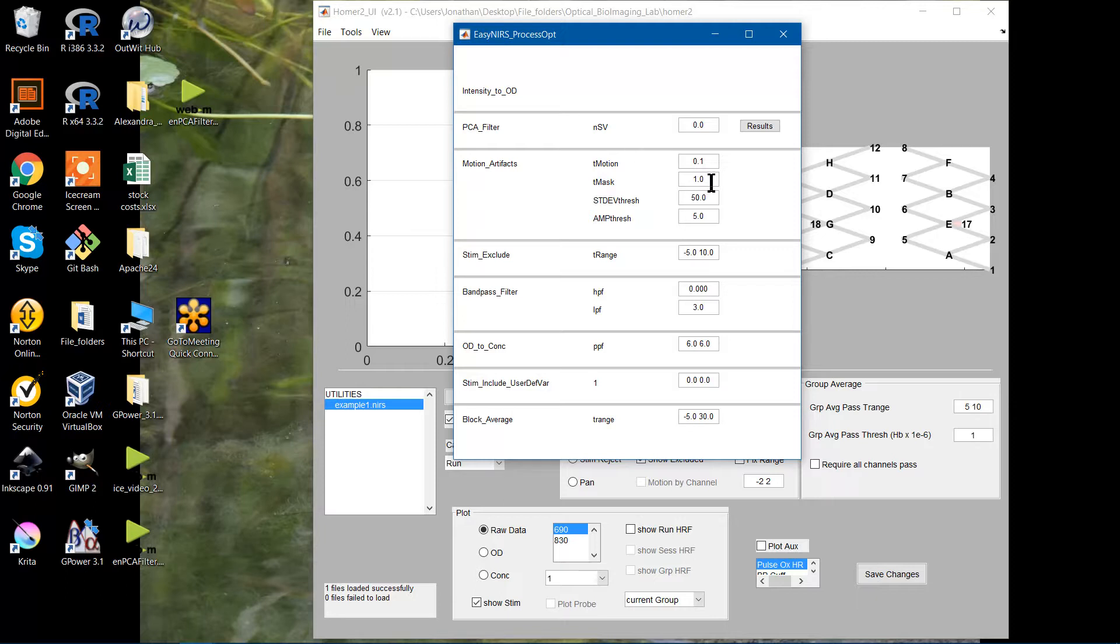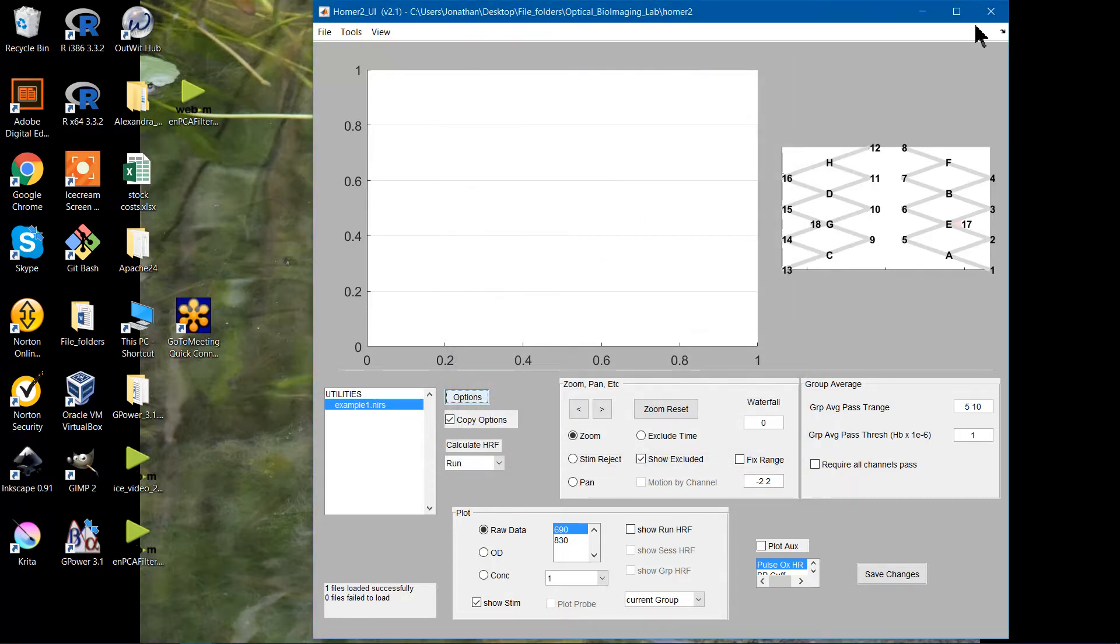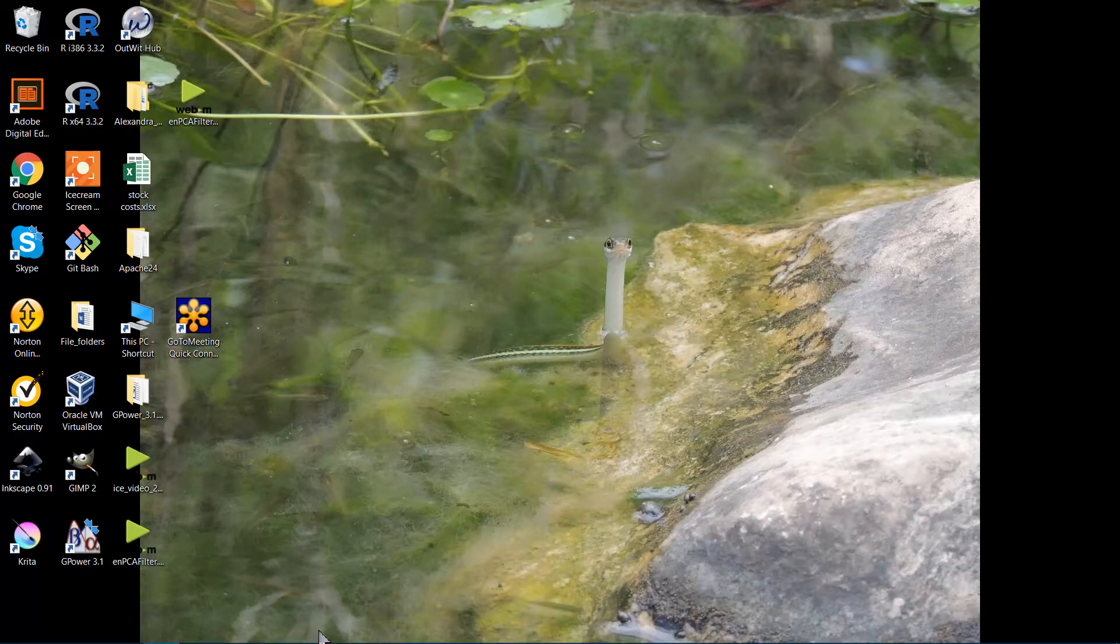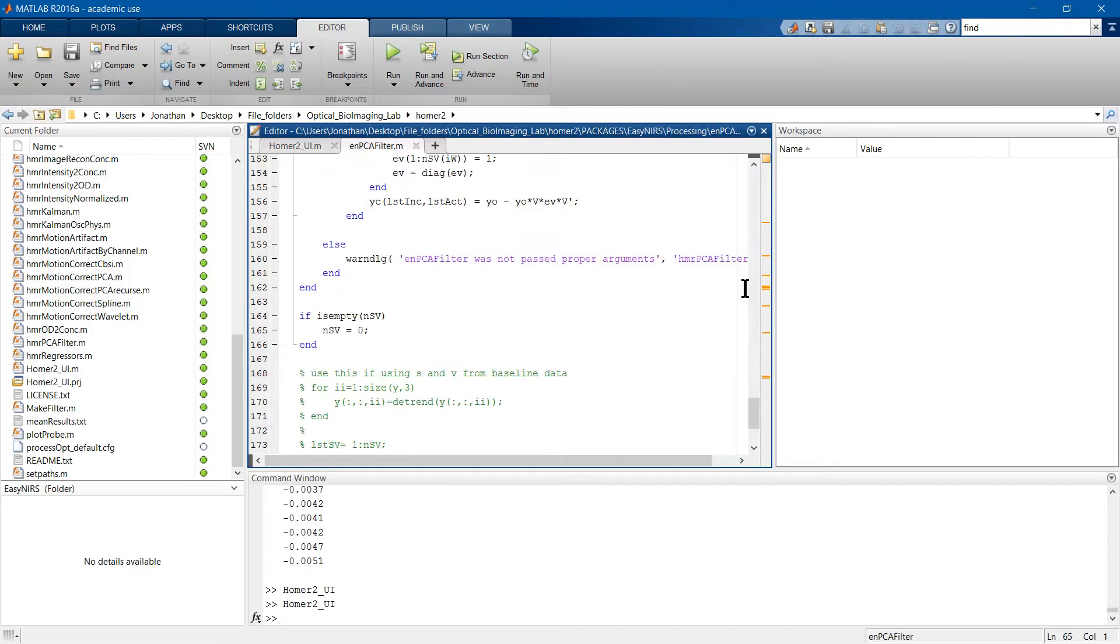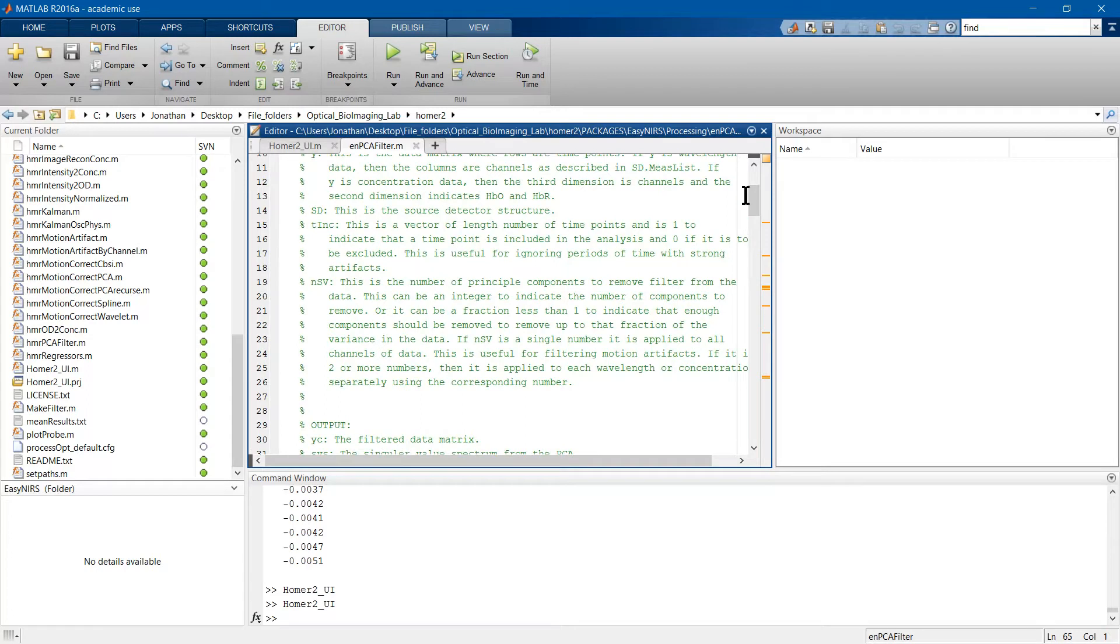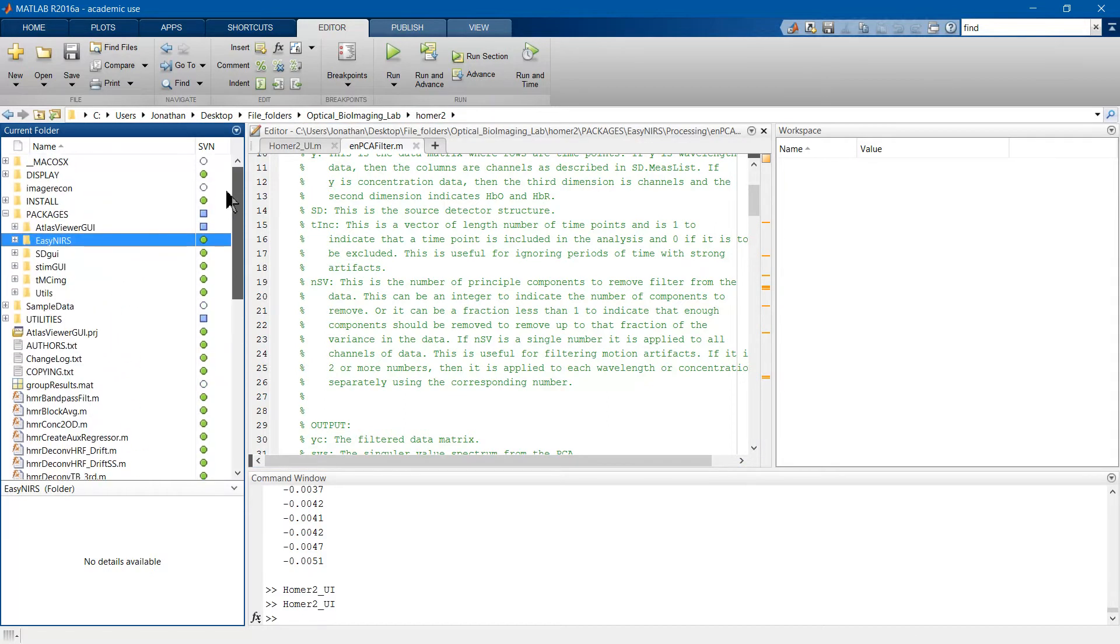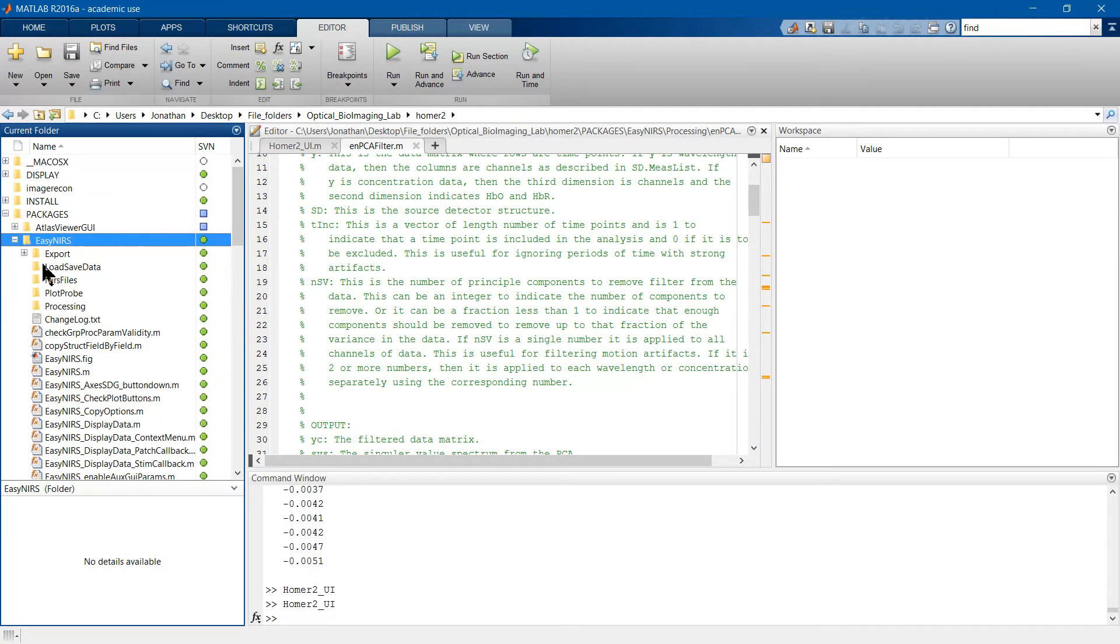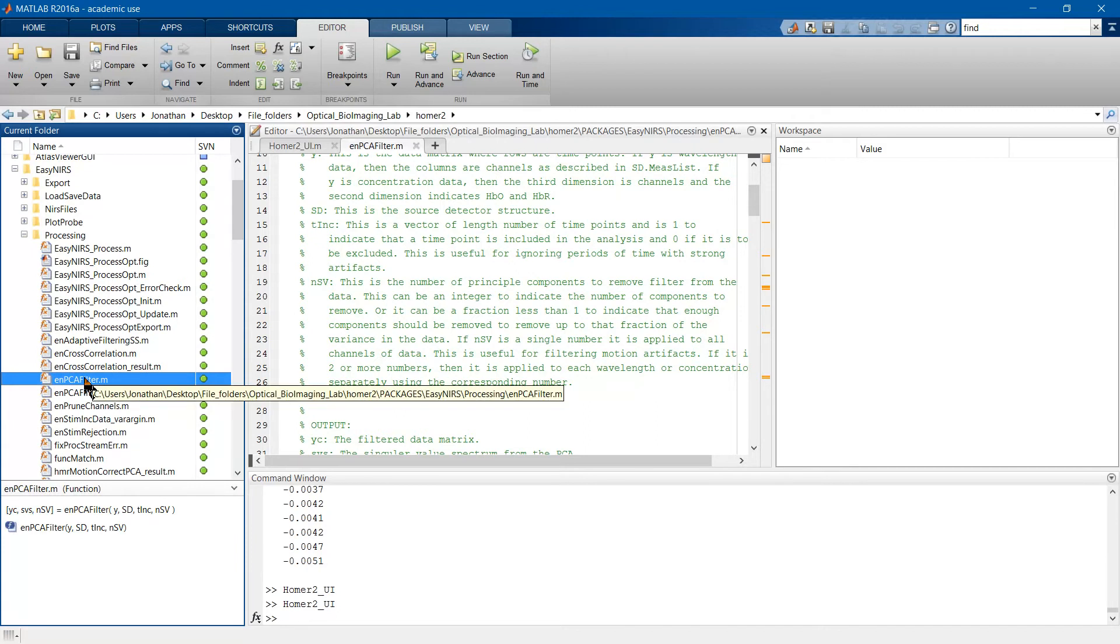Anyway, I hope that was in-depth enough. If you have any questions, feel free to email me. I actually have some notations on the code as well, which may be of some use, and I'm happy to email those to anyone interested. You also, of course, as with any of the Homer work, have access to the code yourself here. So that's going to be found in the Homer folder under ENPCA filter. To find it, it actually is a little difficult. You have to go to Packages, EasyNirs, and Processing, and you will find it right there.